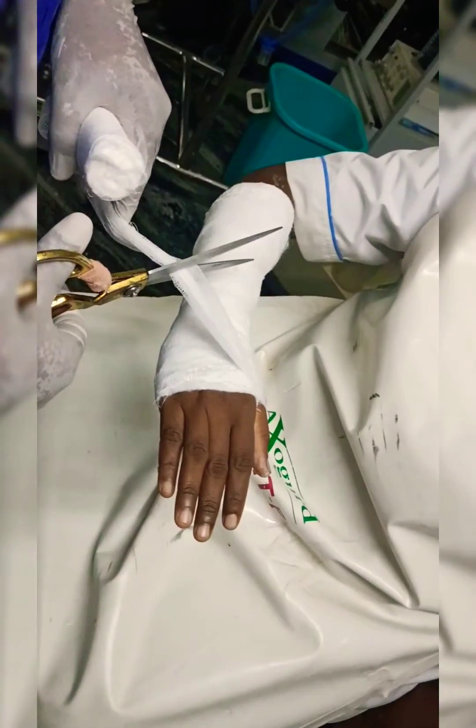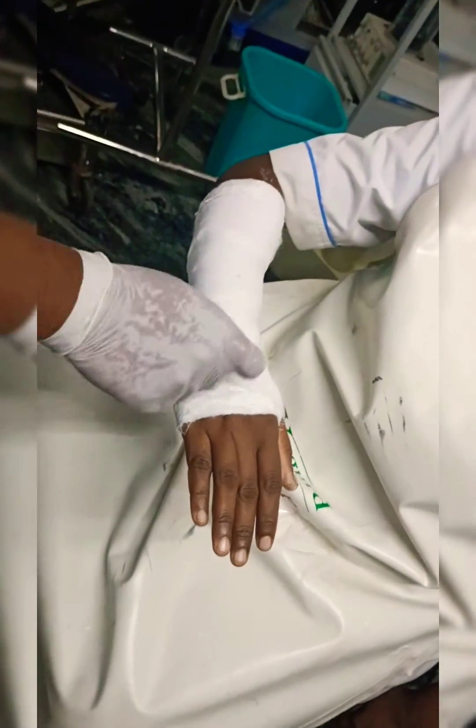After completing, the forearm should be held with the elbow in a 90-degree flexed posture.